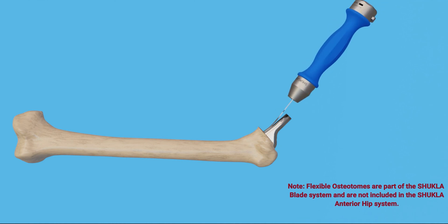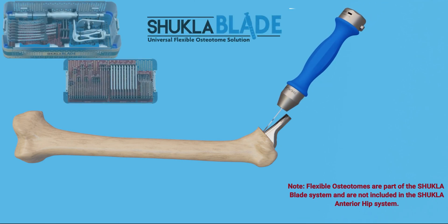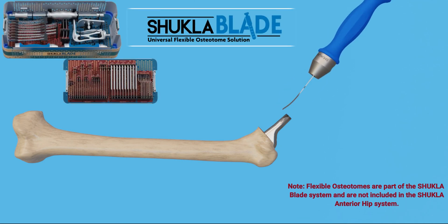To break up the bone interface around the femoral hip stem, use the Shukla Blade Universal Flexible Osteotome System.